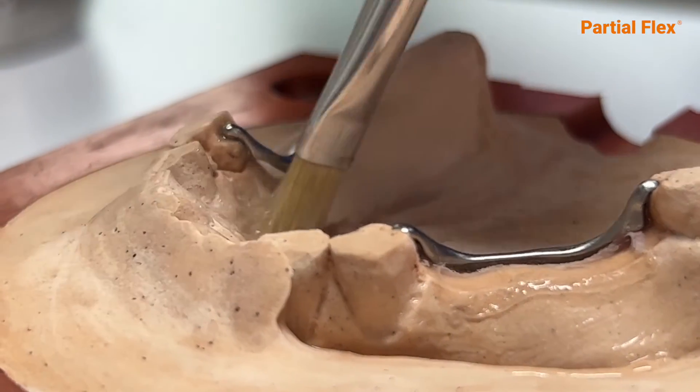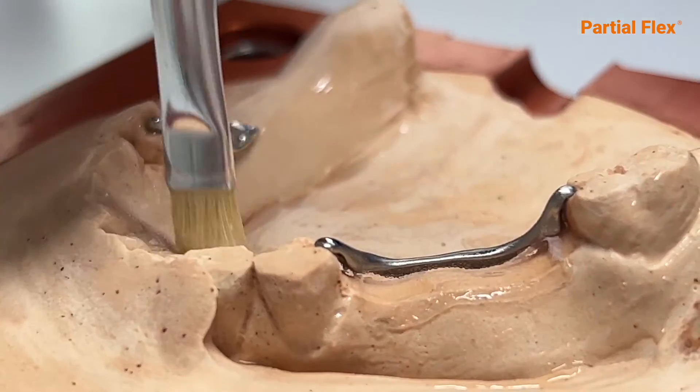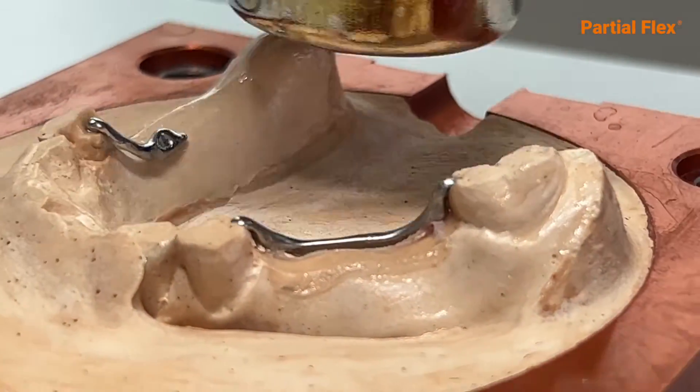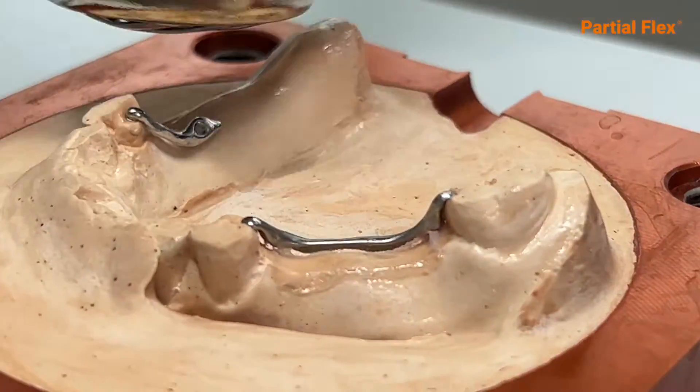Cover all the plaster zone with our sealing polymer, Seal Flex. Apply in two layers. Dry the first layer for one minute before applying the next. Accelerate this by using a heat gun or even a hair dryer.